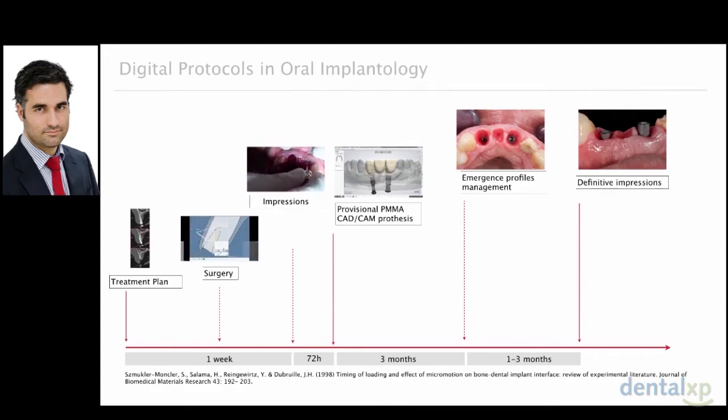I will use PMMA. After, I'm going to explain why I use PMMA. And after that, we are going to manage the emergence profiles till we have the definitive prosthesis. We will do definitive impressions with the intraoral scanner, with a digital protocol.